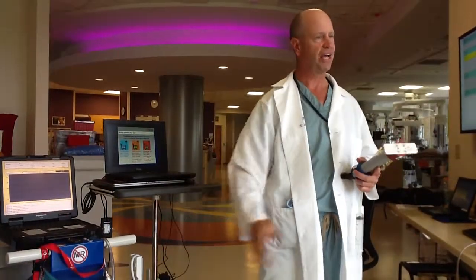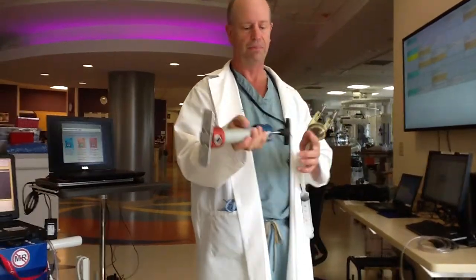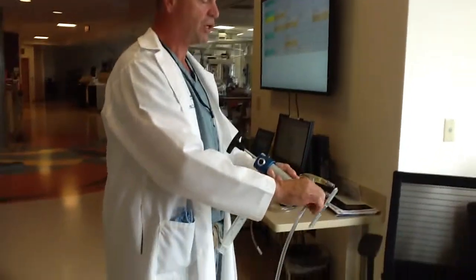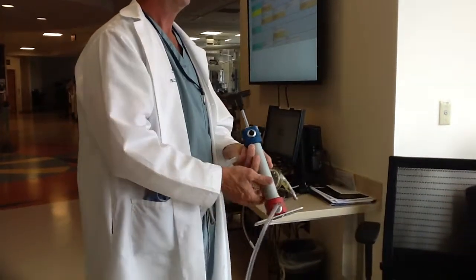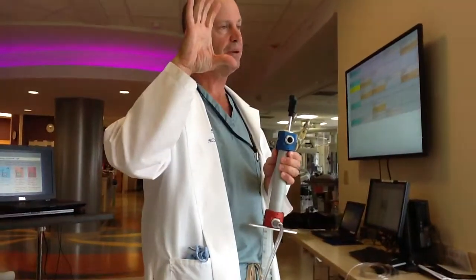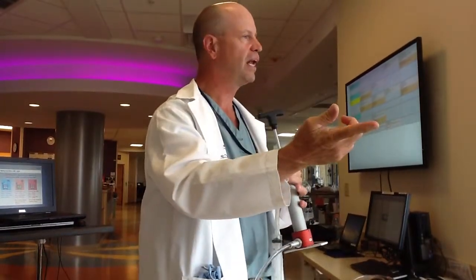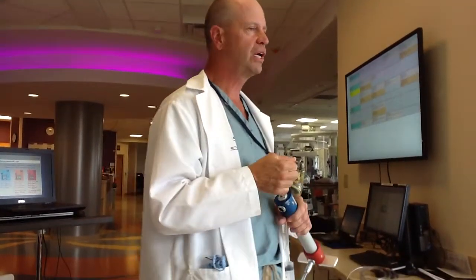Pull the handle out halfway. Take the drive line — she's on an LVAD, so plug it into the red side here. Red is left because it's oxygenated blood; the right side has blue blood, so plug it in and start pumping. This hand pump will operate a 60 ml pump and a 10 ml pump. If you exert excessive pressure on the 10 ml pump, it just blows that excess pressure overboard. Cycle the thing — she's running at 60 beats a minute, so 1001, 1002 will keep her going just fine.